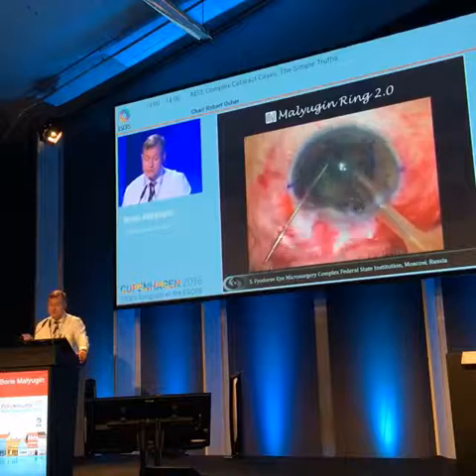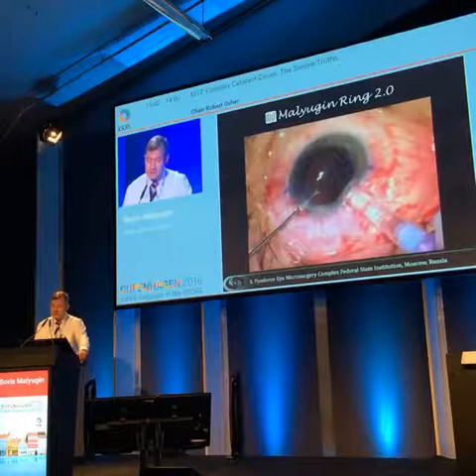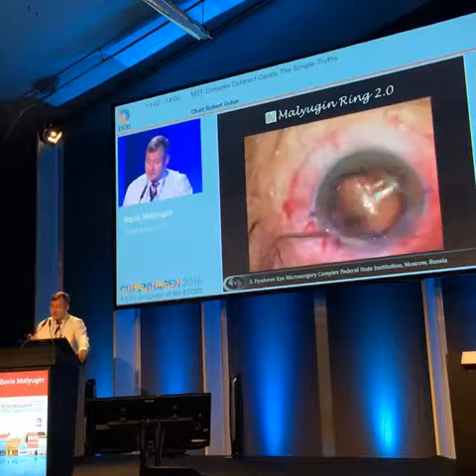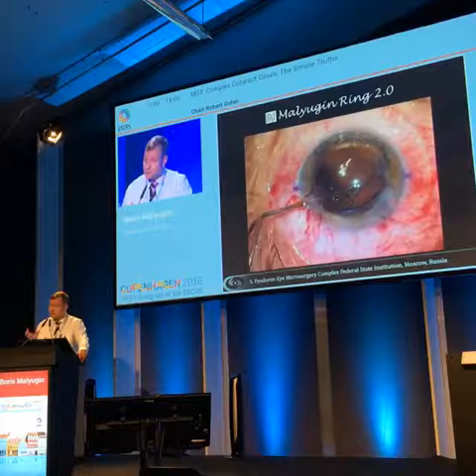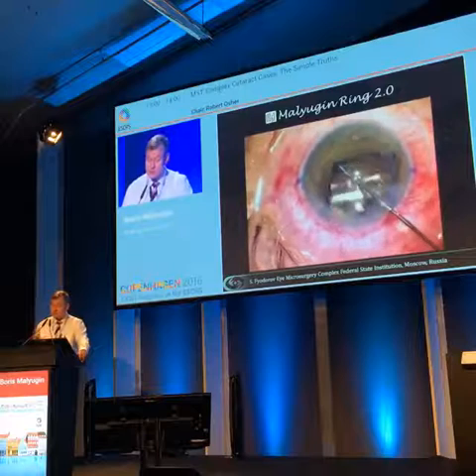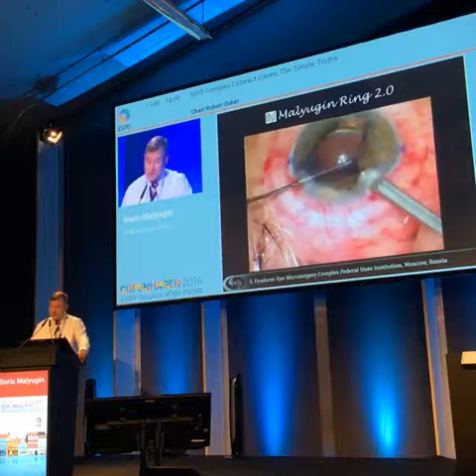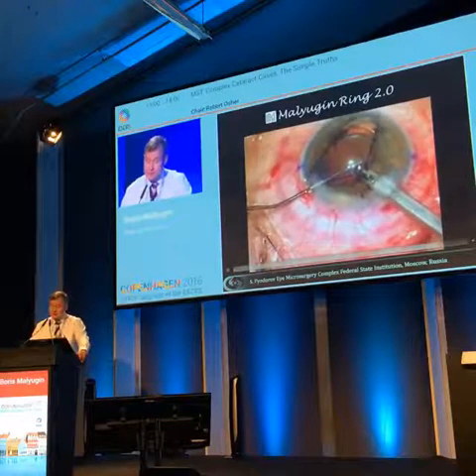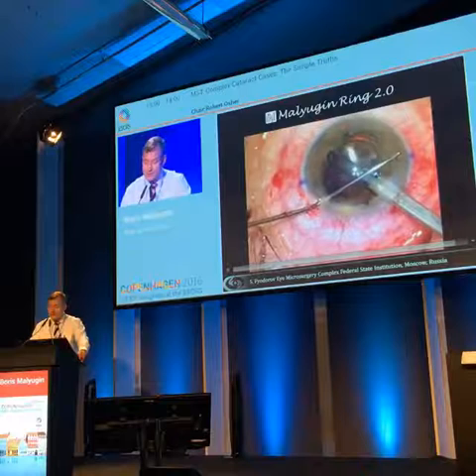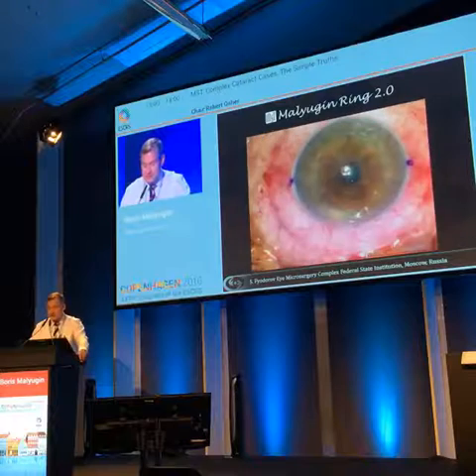And as soon as you've done that, then you're more or less okay, and then we remove the lens and inject this custom-made 12 diopter cylinder IOL into the capsular bag. It's very important when you implant this toric IOL to place this lens properly. And we need a good pupil to be sure that the lens will sit in the right direction and the alignment is correct. So again, I'm not disengaging lateral scrolls to save some time, and then just disengaging distal one, proximal one, and then I'm guiding with both lateral scrolls when they go inside the injector tube, and this is basically the end of the case.